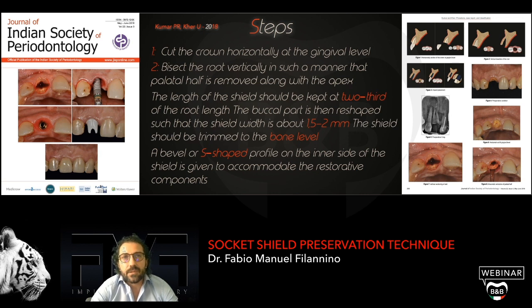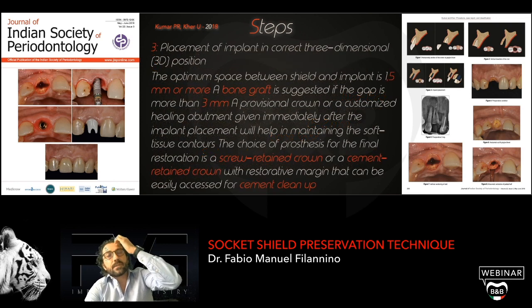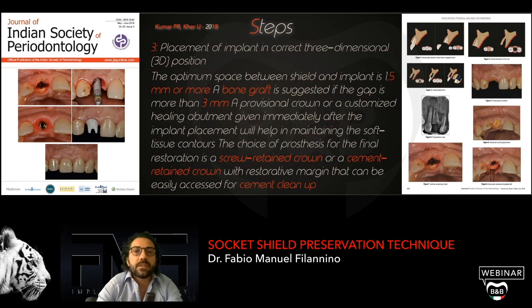Of course, the prosthesis has to follow this design with the S-shape profile so we can have this space maintained with the prosthetic components.